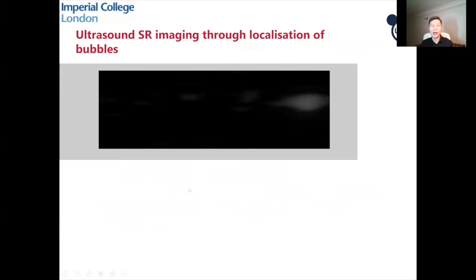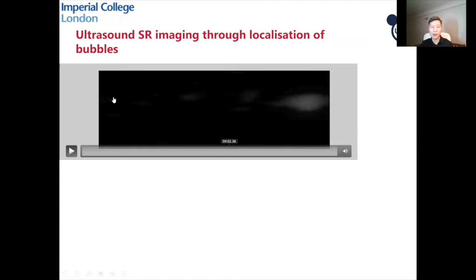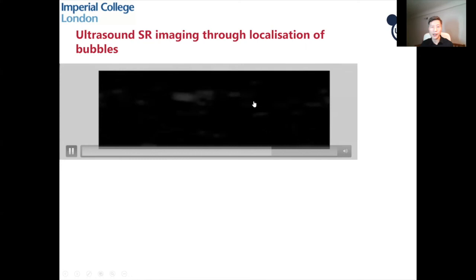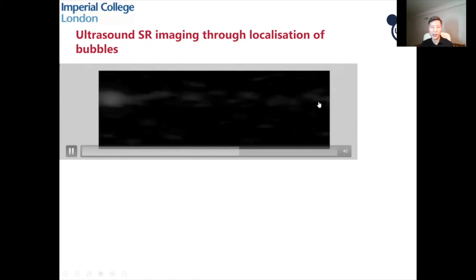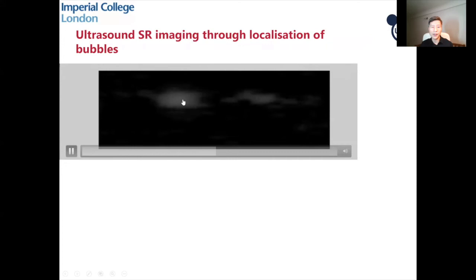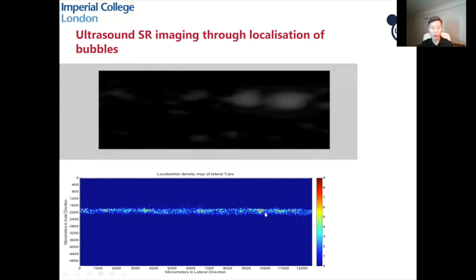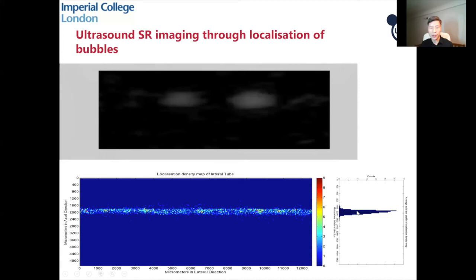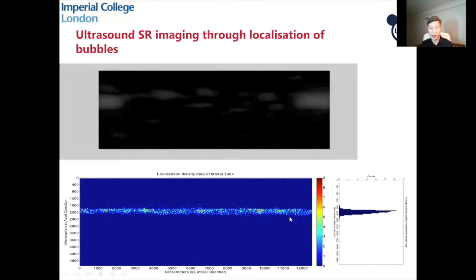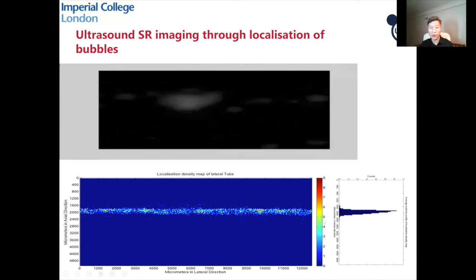Here is some real data. There is a microvessel, and this is the signal of a microbubble contrast agent. When the video plays, you can see the flow going from right to left — signals appearing on the right and moving towards the left. By finding individual bubble signals, localizing them, finding their center, and accumulating over time, you generate a super-resolution image of this vessel. The diameter of the resulting image corresponds to a 200 micron tube, matching the known real diameter very well.